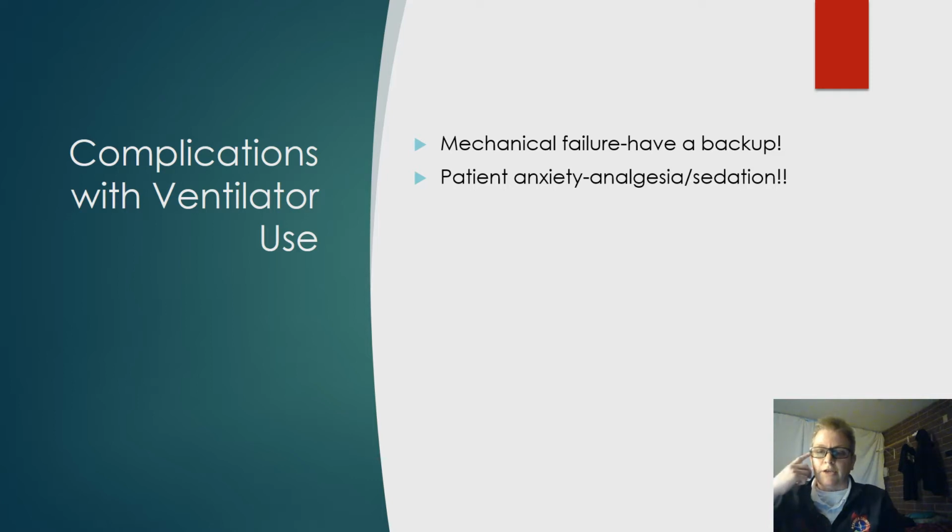Have you ever seen your post-intubated patients have that tear in their eye? It's not because their eye is feeling bad. It's because they can feel what you're doing to them, and it's not comfortable. Analgesia, sedation, analgesia. Whatever you use post-intubation, please do. Carrie asks us over and over again to make sure that we draw those up, even while we're setting up our intubation stuff, and then give it quickly afterwards.